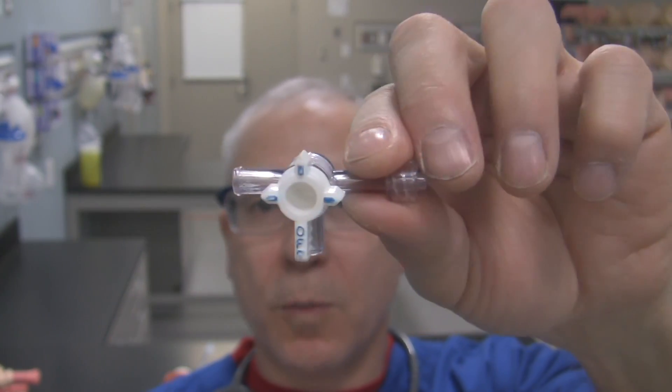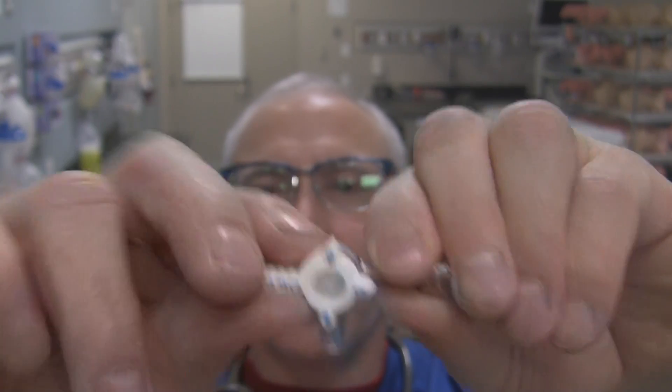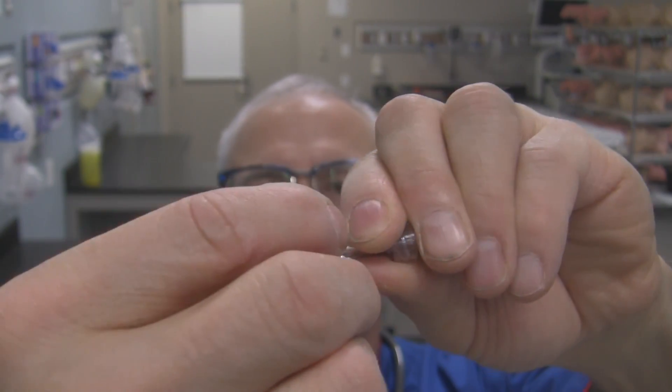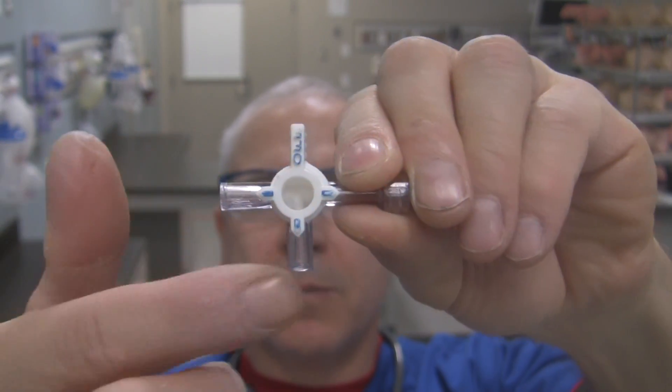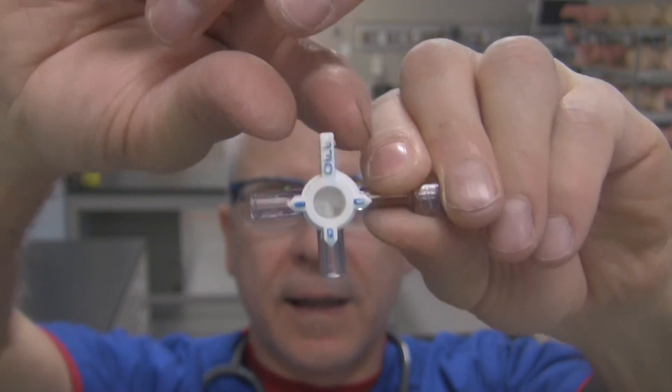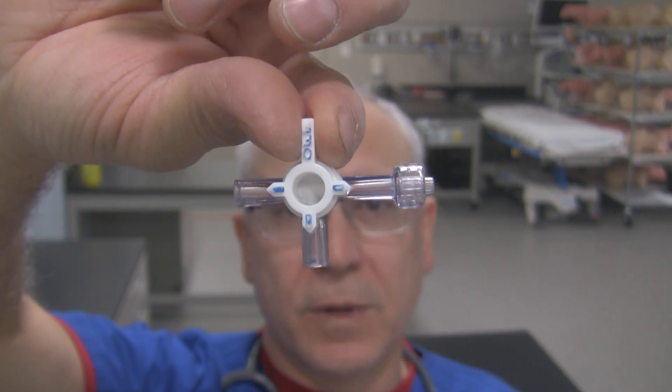If I wanted to have all three ports open, what would I do? You guessed it. Take the off port and place it in that configuration. Now I've got these little blue tabs pointing to every single port. That means all three ports are now open to each other and can communicate with each other.